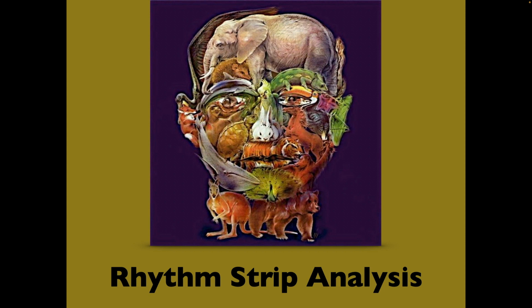So remember, it's kind of an oddity that the QRS complex is defined by the amount of time it takes, which is a little odd considering what a complex little structure it is, but that's how we define it. So Cody, is a Q wave negative or positive, and where is it within the QRS if it's there? Q is the first wave, and it's a negative deflection. Correct. If there is a Q wave, and there's not always one in a QRS, it's the first negative deflection.